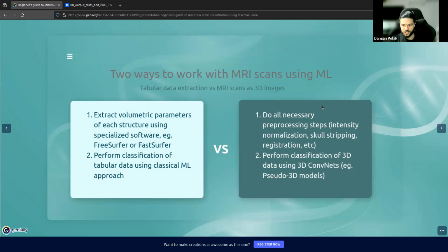Both methods are widely used and researched, with many papers based on this approach. One of the challenges I encountered during my work with MRI data was finding a proper way to preprocess the MRI data for the model training. I will demonstrate how to do this later and aim to explain why it is necessary and show you the results of each preprocessing step.